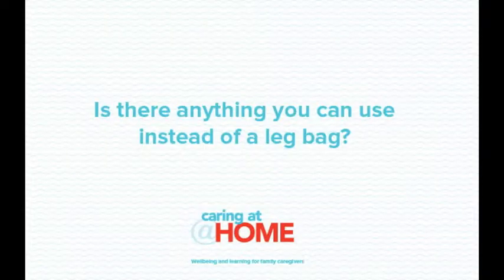Is there anything you can use instead of a leg bag? People using a urinary catheter may find that a urinary catheter valve is more suitable. This valve is connected directly to the catheter and the tap on the valve is released every three to four hours or when the bladder is full. At night the valve is connected directly to a night bag. This product is useful for people with good hand and bladder function. Talk to your health professional to see whether this is an option for the person you're working with.